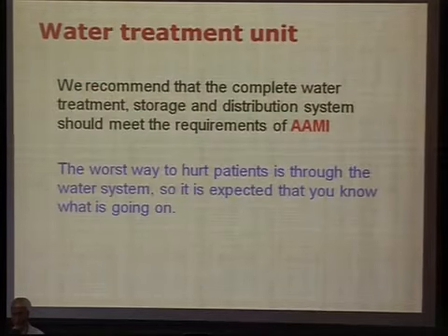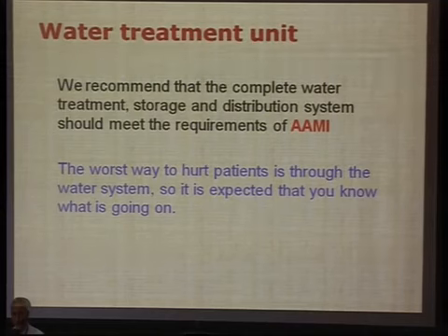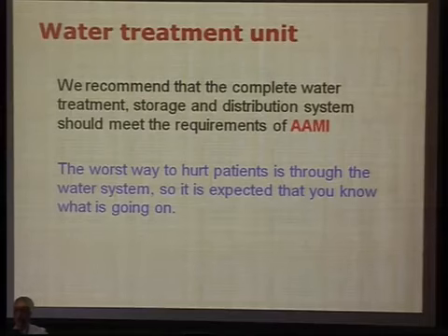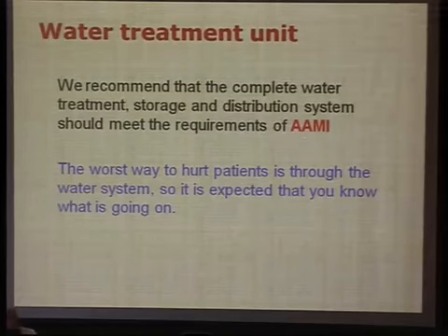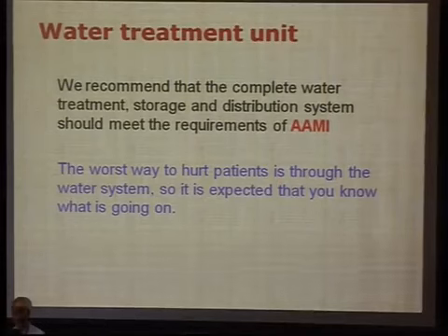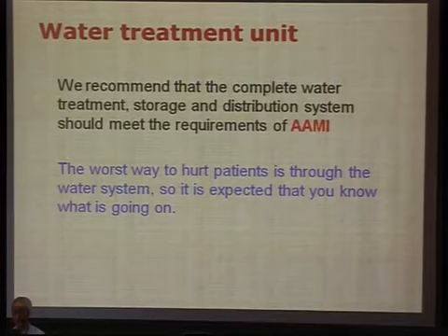Regarding the water treatment unit, which is a very important point, they recommended that the complete water treatment, storage and distribution system must meet the requirements of the AAMI standards. It is very important to know the AAMI standards for the water treatment unit. The worst way to harm patients in hemodialysis is through the water system. If you look at this statement, the worst way to harm patients is through the water system, so it is expected that you know what is going on.